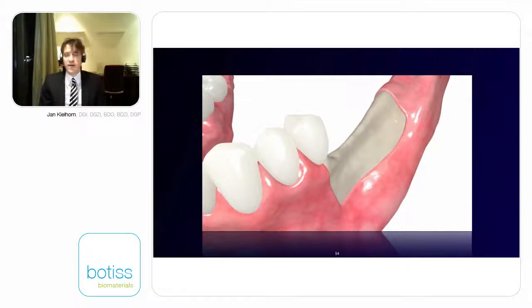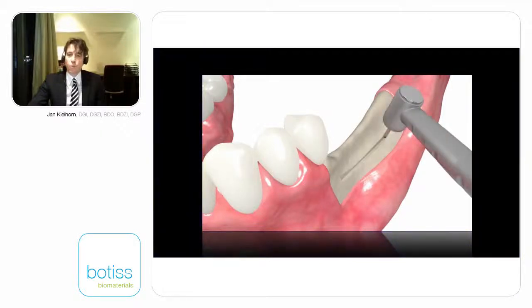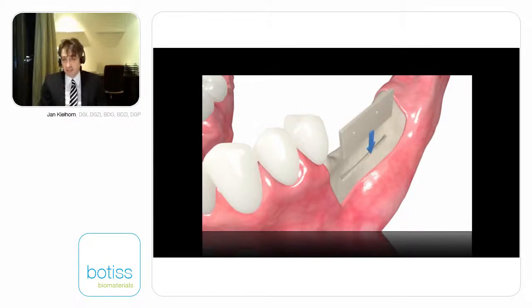Another technique we developed for that is the feather nut technique. That means if you have a ridge in the lateral posterior, it's often very difficult to screw on a plate at a distance to hold that. To make that even easier, we provide you with a little 1 millimeter, 0.8 millimeter thick burr, which creates a little groove at the right spot, and then you are able to place the cortical plate into this groove, make it very stable, and then very easily fix it with the osteosynthesis screws. That's called the feather nut technique.